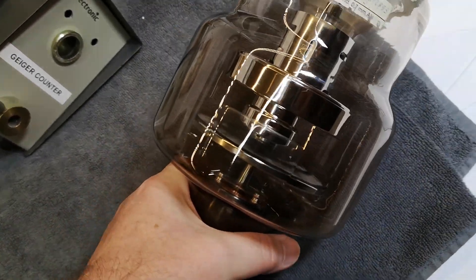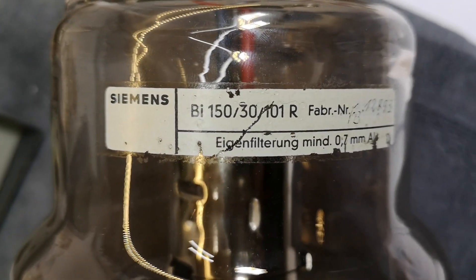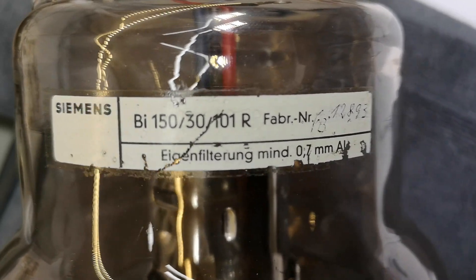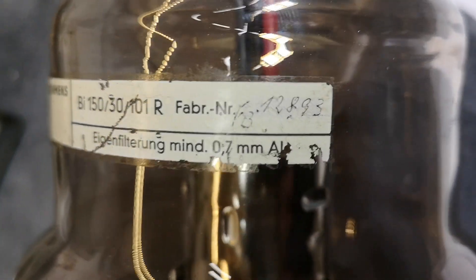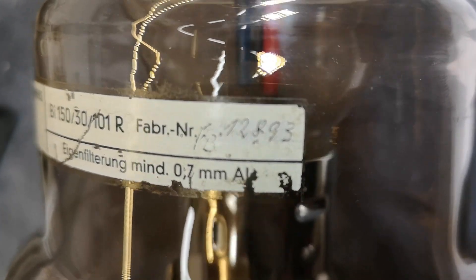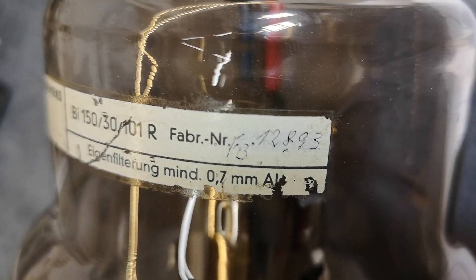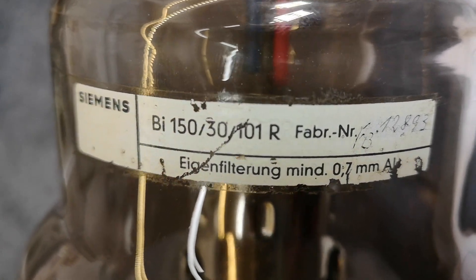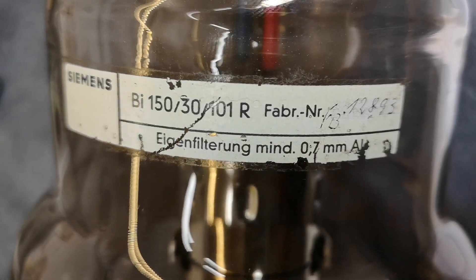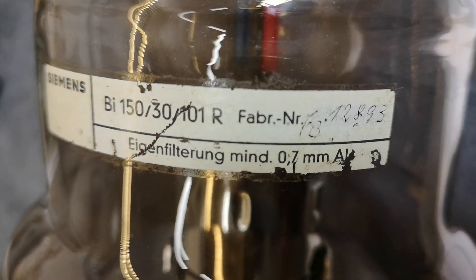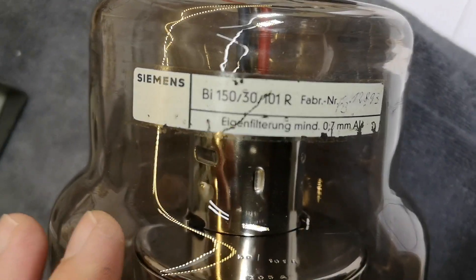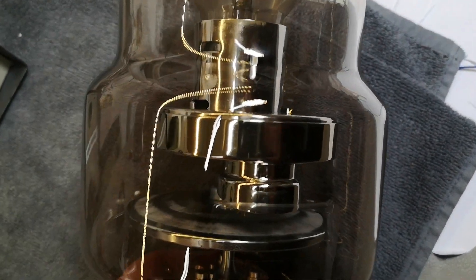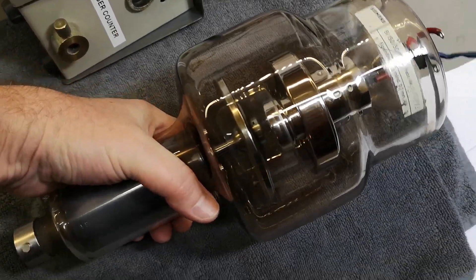It's from Siemens, a BI 150 30 101 R. Here's the fabrication number. If anybody knows how to google this and find the exact specification sheet with all the details, I would be very interested. I can only find similar tubes, not exactly this one.